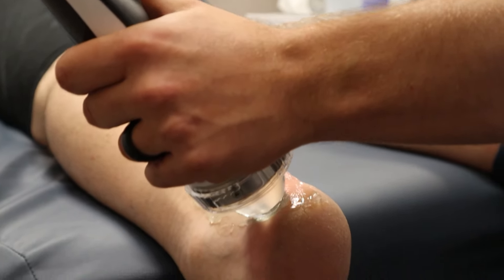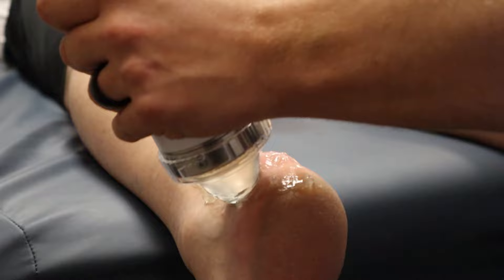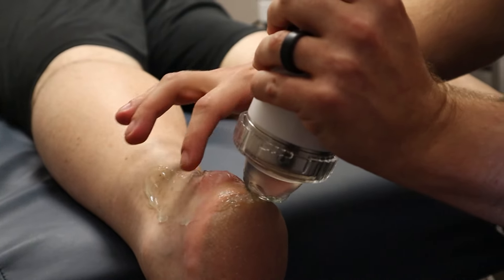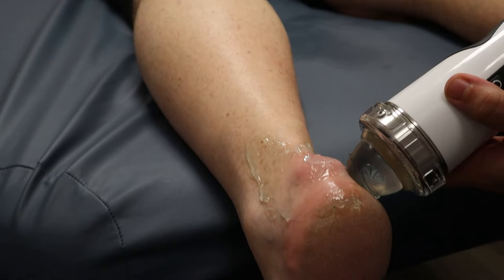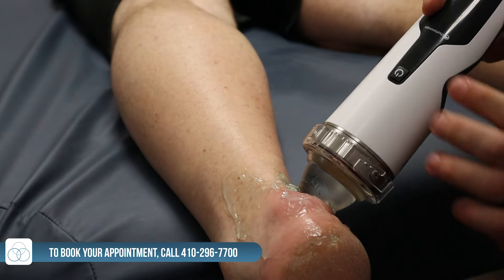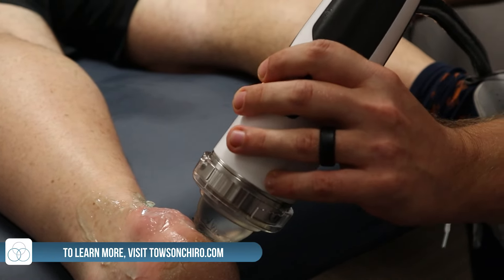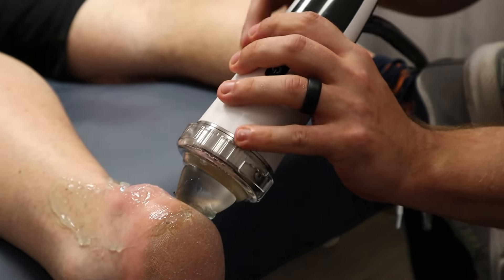So we're going to first just go kind of lightly for our patient here. We don't want to immediately fire up this spot, but you can kind of see that swelling on the Achilles heel. You can see where our focus is going to be. We're just kind of priming up the areas nearby it, and I'm going to slowly start to increase our pressure as well.